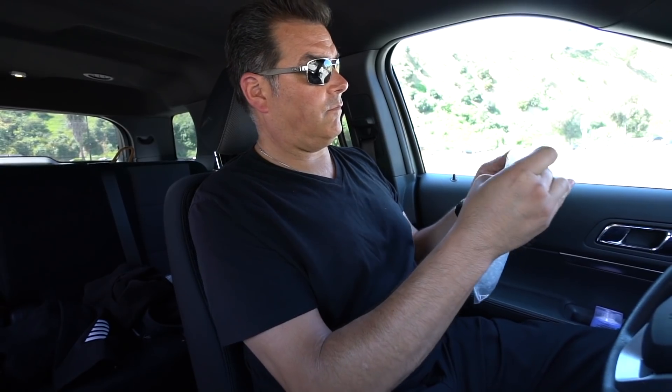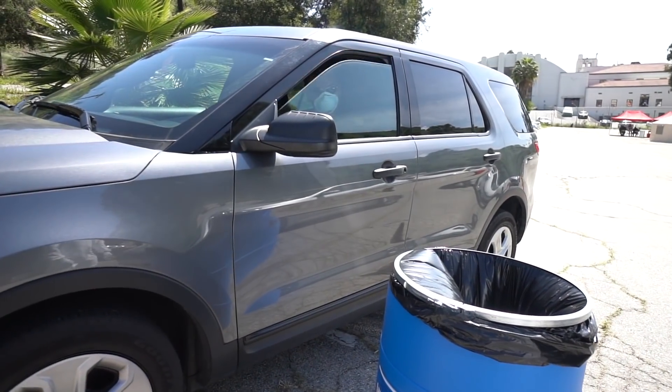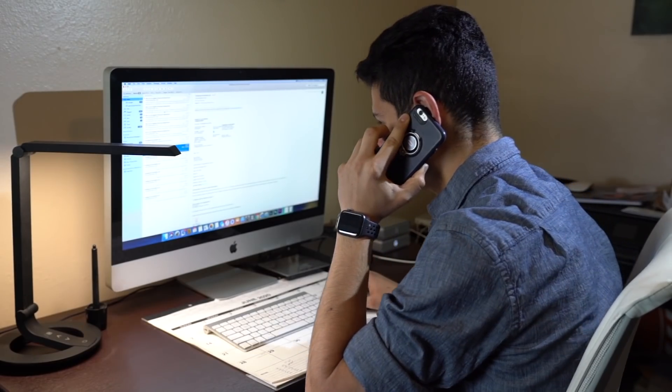Step 9: Place the bubble wrap pouch inside the large biohazard bag and seal the top of the bag. Once your sample is securely packaged, you may place the kit into the collection bin for transport. Turnaround times may vary, but your results should be ready within a few days. You will receive your results via email or phone.